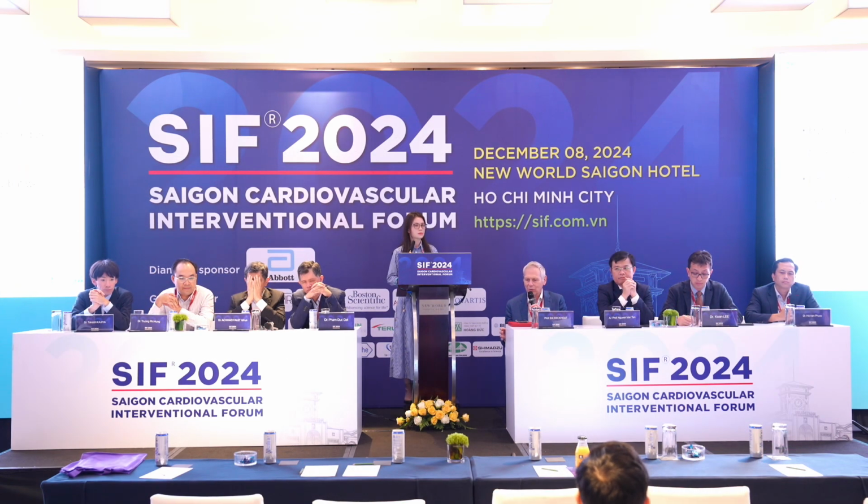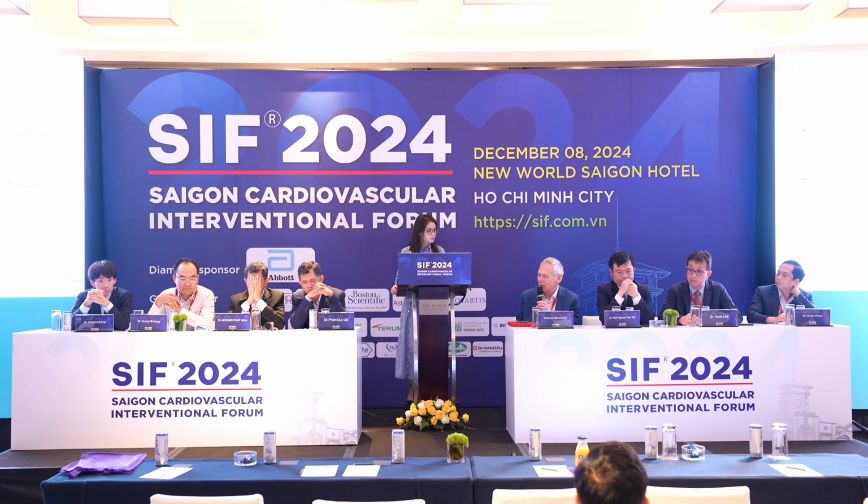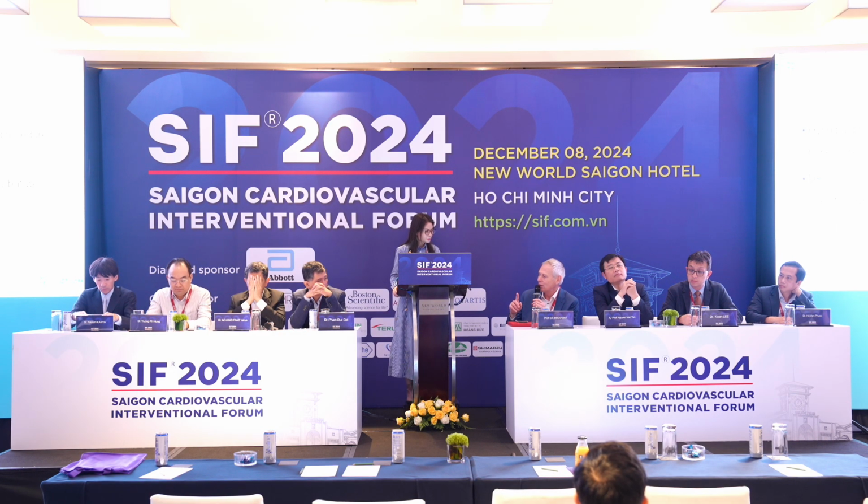Thank you very much for your nice lecture and also for being on time. Your first case was very nice because there's a fistula to the pulmonary artery, a small one, and we looked at it together. After stenting, the fistula closed down, because often the vessel wall of this fistula is quite fragile. So I think at the moment you stented it, you just closed off the fistula. That was just a small observation.